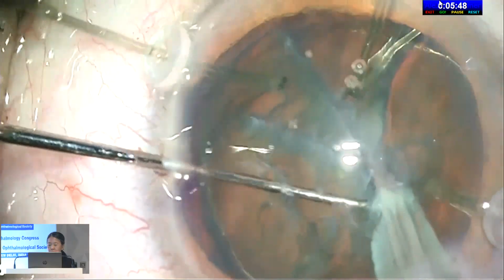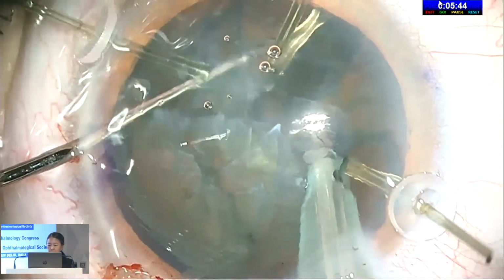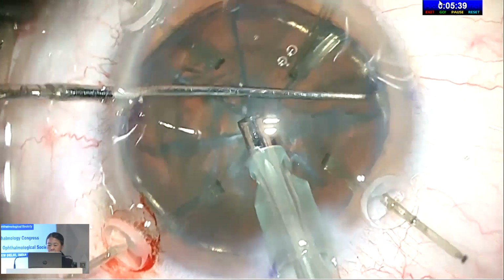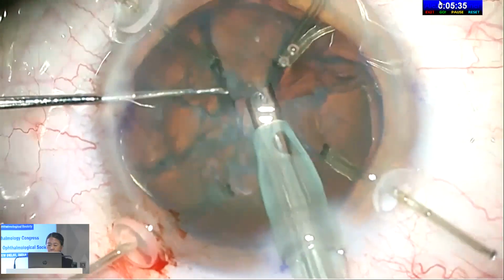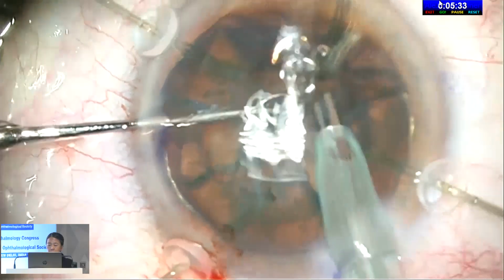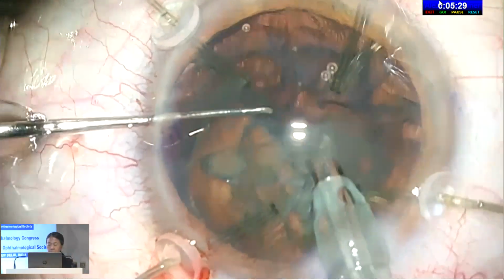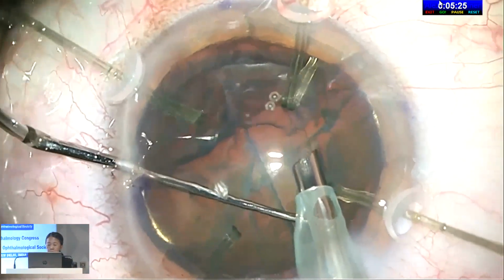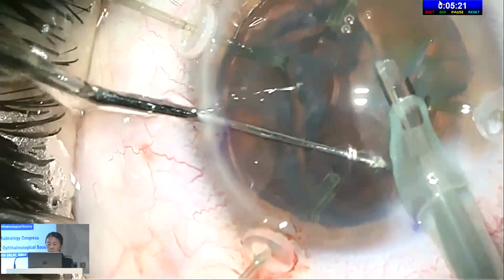All right, you can do some gentle hydrodissection. Sometimes you don't need it because you got viscoelastic there already. That's dissected off the anterior cortex, and then this is without rotating. You can just tumble the pieces out using the chopper, all right, to just bring it forward, and you can see that this piece comes out very easily because it's already pre-chopped. In this case, again, just bringing it forward. Okay, now this is completely loose.